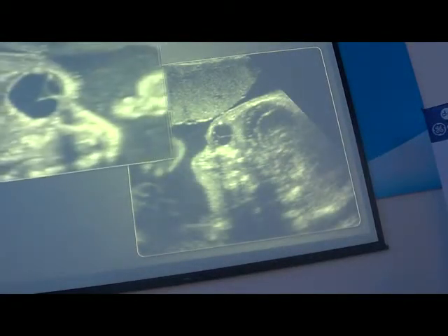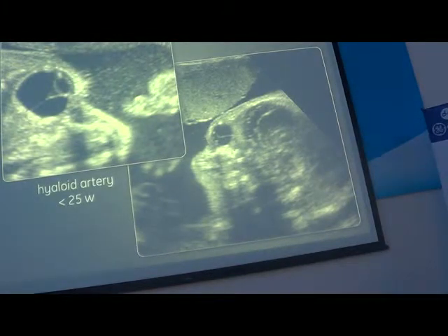If you do this lateral view of the orbit, sometimes you will find this behind the lens, and this is a remnant of the hyaloid artery. This is normal until 25 weeks. Ở đây các bạn nhìn thấy cái hình ảnh của cái động mạch thủy tinh thể. And it will disappear after, and if you find this in the third trimester, this is abnormal. Nếu như vào quý 3 các bạn vẫn còn nhìn thấy cái này thì đấy là bất thường.